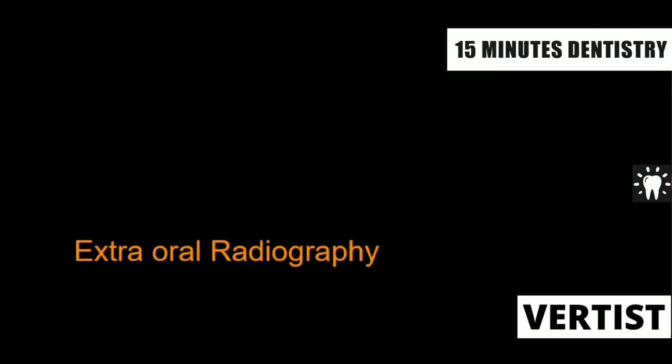extraoral radiograph. Extraoral radiographs are needed many times whenever there is extensive pathology which cannot be captured in an IOPA film or the occlusal film. So pathology related to the jawbone, maybe a benign tumor, maybe a cystic lesion, maybe a fracture, maybe a developmental anomaly, maybe some congenital TM joint diseases, for all these we need extraoral radiography.